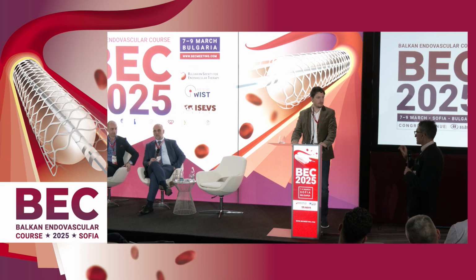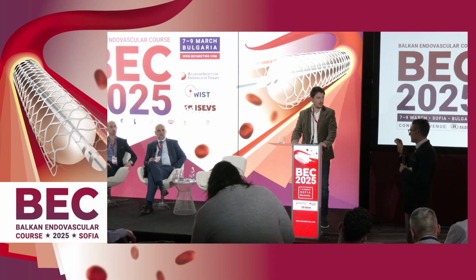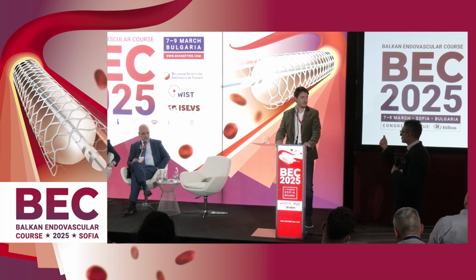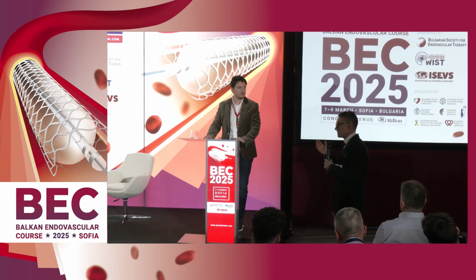And what has been shown, in the majority of the cases, especially in critical limb ischemia, is that we have to perform with all the possibilities that we have. Retrograde approach through the loop, through the collaterals, antegrade, retrograde, brachial approach, radial approach, tibial approach, and so on.